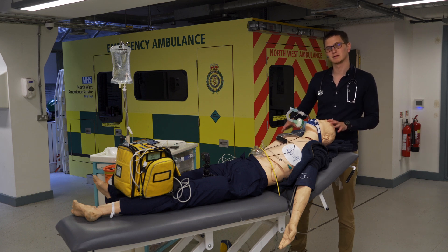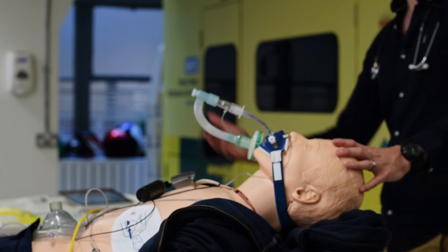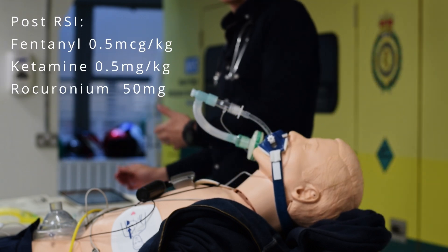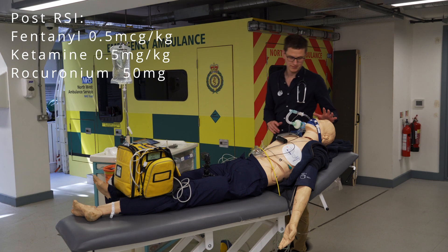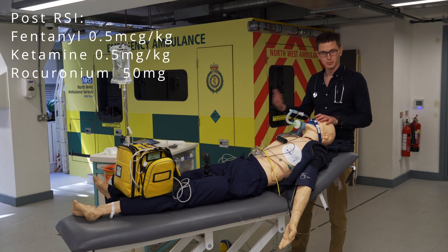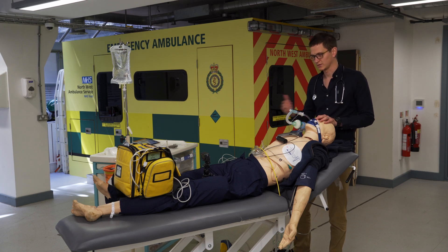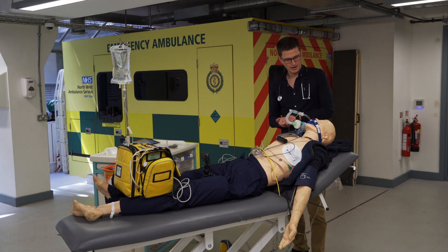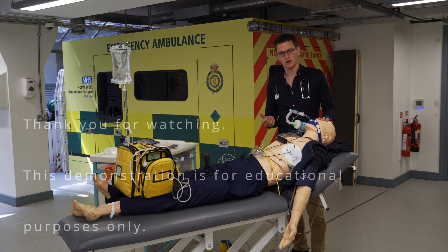He's also receiving the ketamine and the fentanyl, so we now need to think about top-up sedation or post-intubation sedation. If you still have ketamine and fentanyl remaining, you can use those. We had no problems with the intubation — now we get the patient onto the ventilator with normal vent settings. We won't cover vent settings in this video. We had no complications, and that is the process of your RSI.